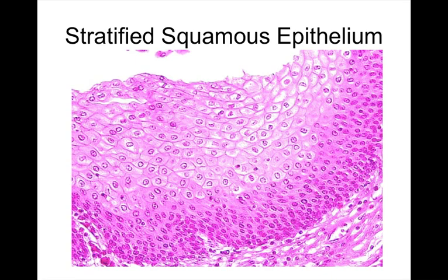Do you think this is the epidermis? Usually when we look at the epidermis, it's nice because there's sort of a color change at the base of the tissue, but you see there's still a lot of open space here. The cells aren't particularly packed together. If this were the stratum corneum of the skin, those cells would be all really flat, and we'll also see when we look at the skin later that they really pick up the stain a lot. So it almost has that really dark fuchsia color to it.